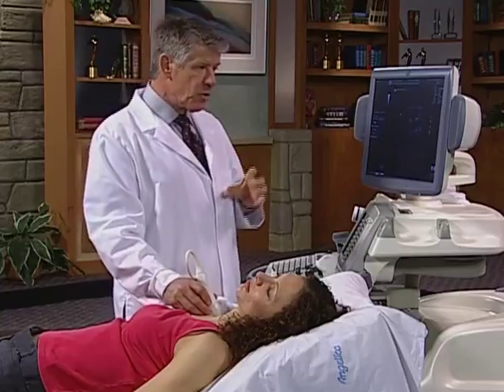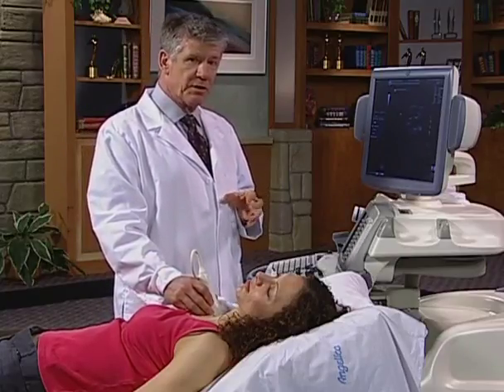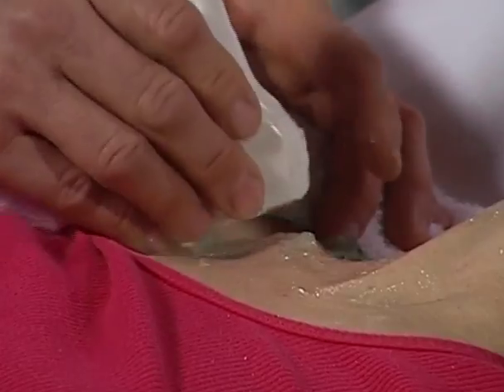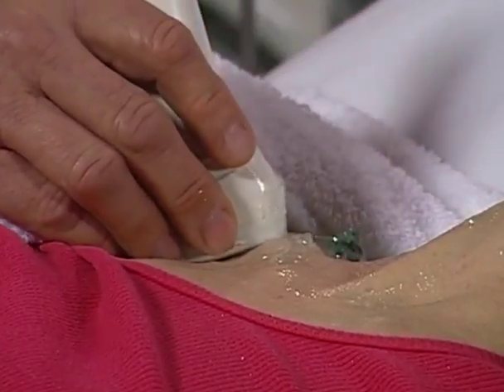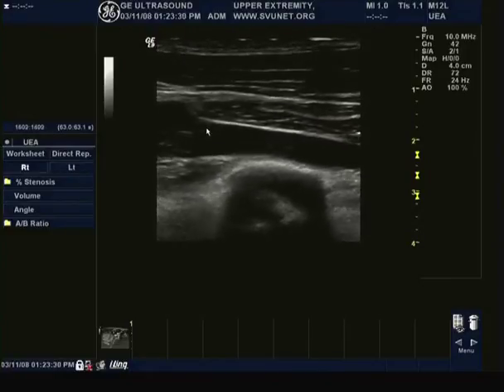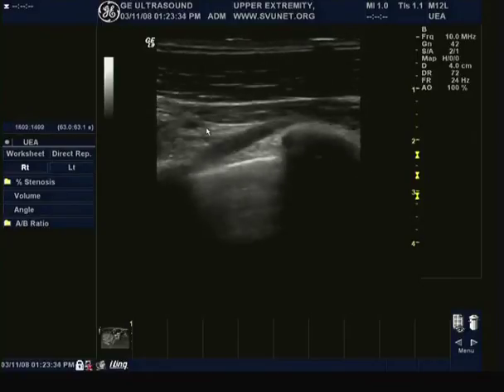That's the normal orientation for a carotid exam, but it's a little atypical for a subclavian artery exam, so I tend to keep that orientation until I cross the clavicle. Distal to the clavicle, in the infraclavicular region, we have the hand to the right of the screen on these arterial studies. We do that for both the left and the right, and it helps with orienting which way flow is supposed to be going.